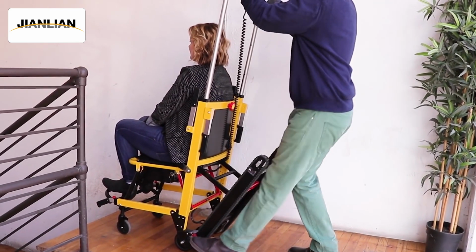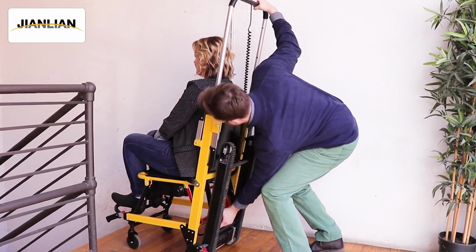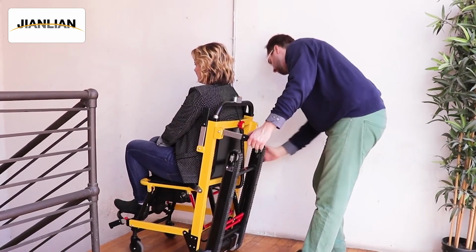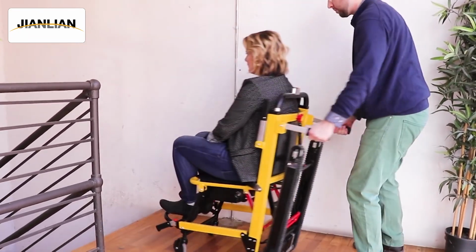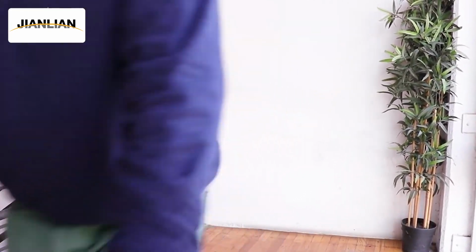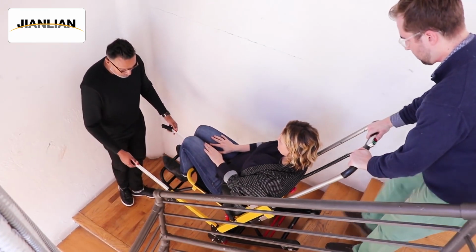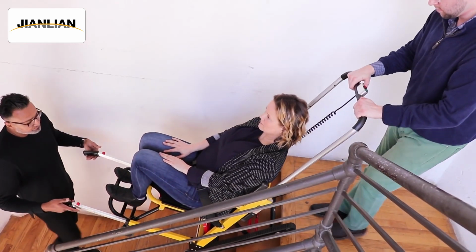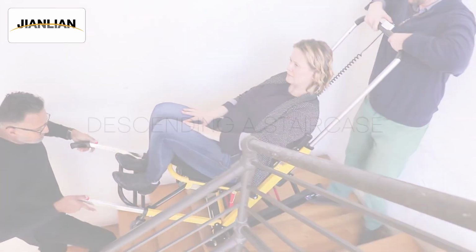Lock the back wheels, fold the tracks into the upright and locked position, and rotate the red knob to slide the handlebar down. Then fold out the 2 handles on the back of the seat, unlock the back wheels, and wheel the chair away. While it is possible for one person to easily operate the stairlift, it is our strong recommendation to have a second operator stand below the stairlift and act as a safety spotter and emergency backup. The handles on either side of the footrest can be extended for the second operator's use.